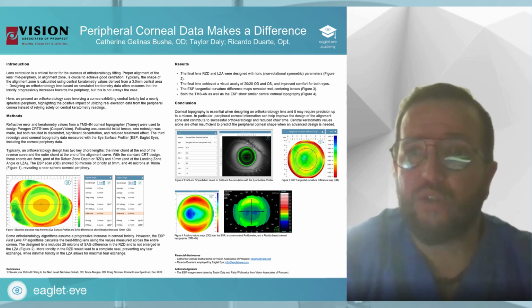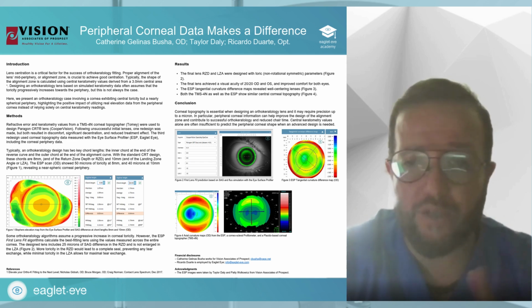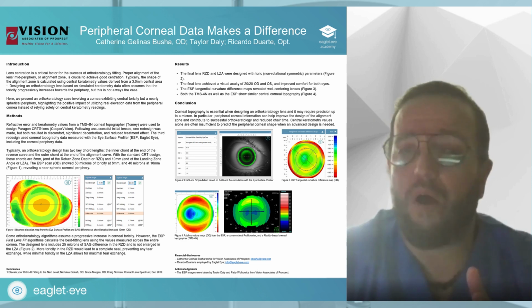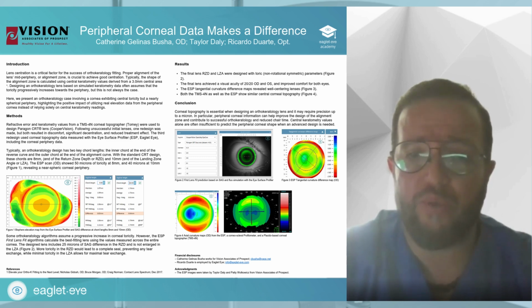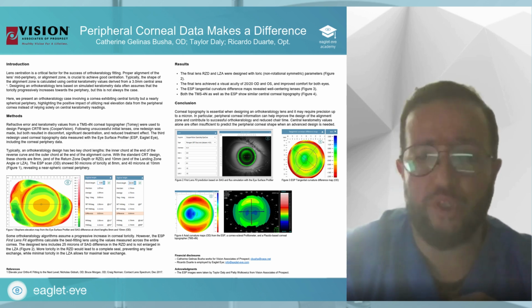center. So I have done it once actually, where I fitted a patient just with the autokeratometer K readings, and it was awful. And it was awful, and I said to myself, never again. I need more precise data. So when I started working, I started doing just a regular corneal topographer, but then I switched to the ESP.